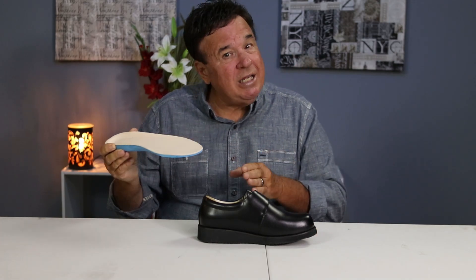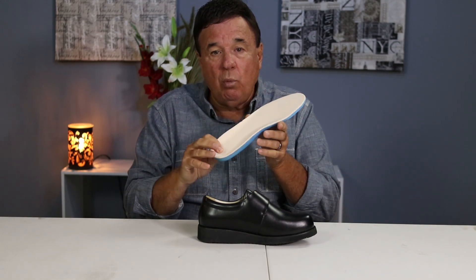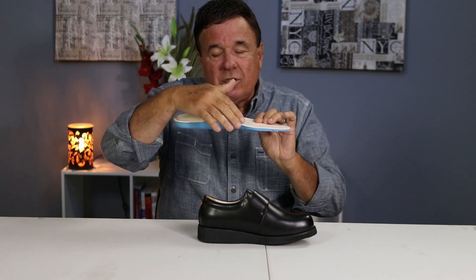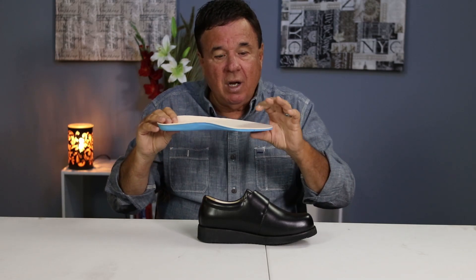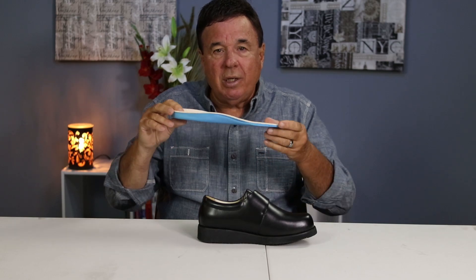What's so unique about our moldable customized inserts is it's got the best cradle heel in the shoe world, has the best raised arch for over-the-counter, has great metatarsal support, and a T-bar support to it. Look at the durometer — the thickness of it. When you compare it to normal inserts, they're as flimsy as can be. This will mold to your foot, and it'll be unique and unbelievable.